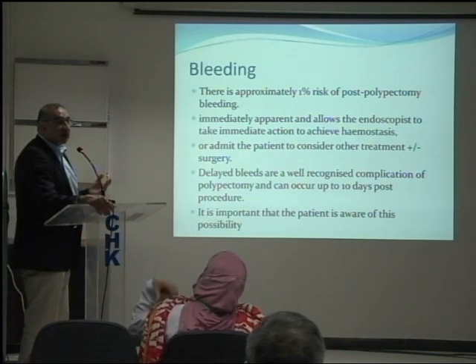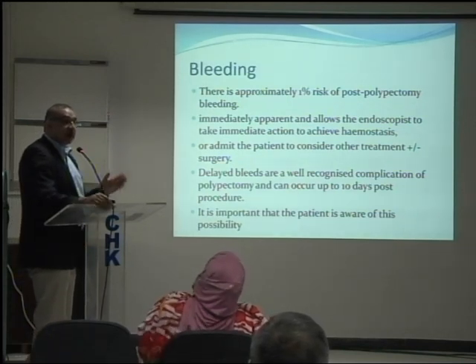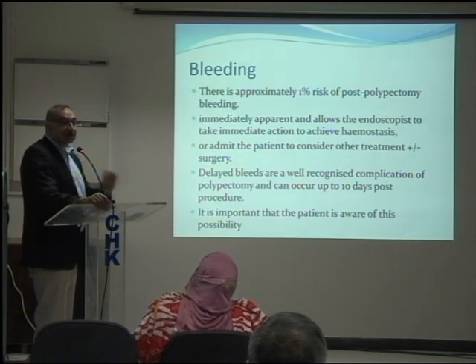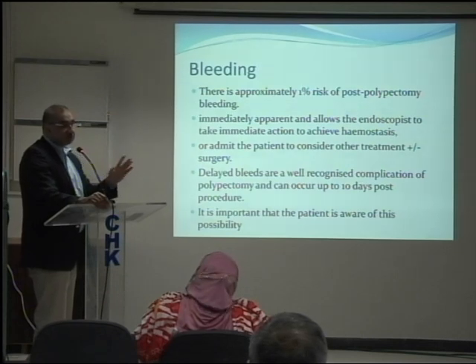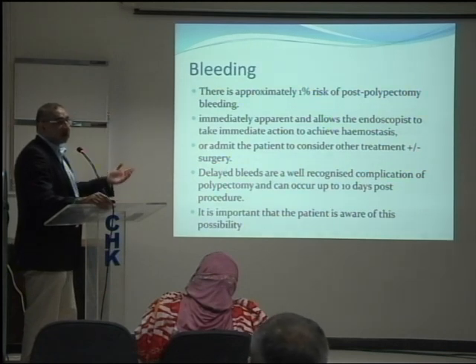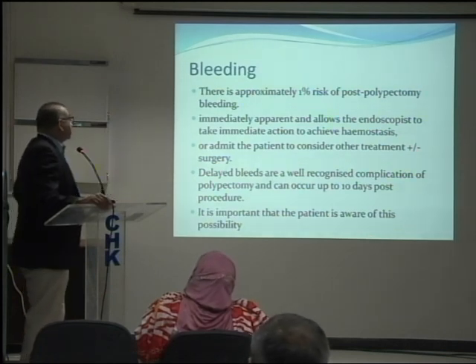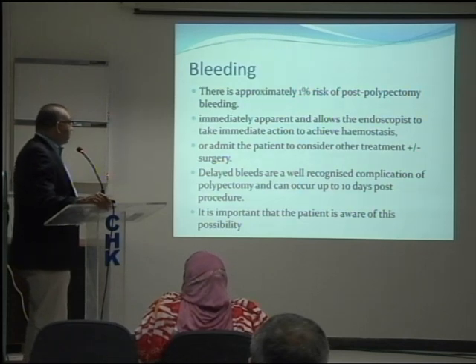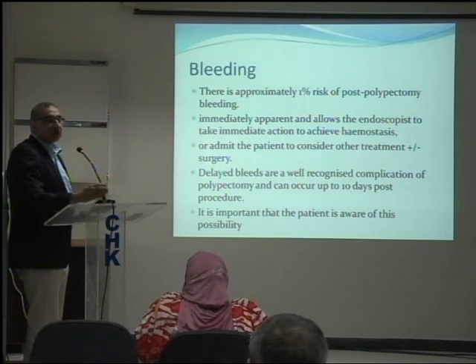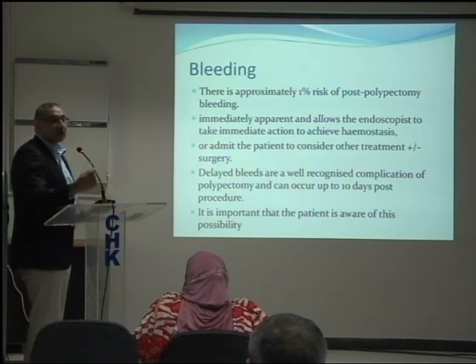Even if the patient is on anticoagulant and they have their INR in the therapeutic range of 2.5 to 3.5, still very unlikely to get bleeding from a diagnostic biopsy. Right? So it only can occur during therapeutic endoscopy, like polypectomies. Usually it occurs when we do polypectomies, and most of the time, as you take the polyp out, the thick stalk, a vessel, has missed the cauterization or coagulation, and you see a spurter or an ooze.